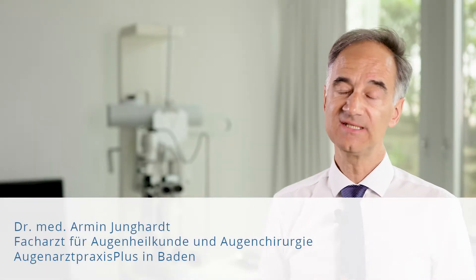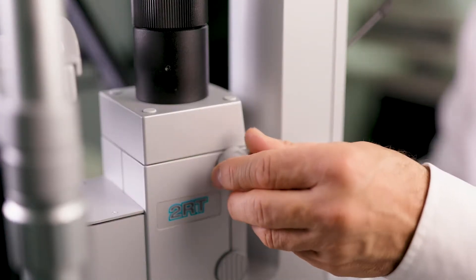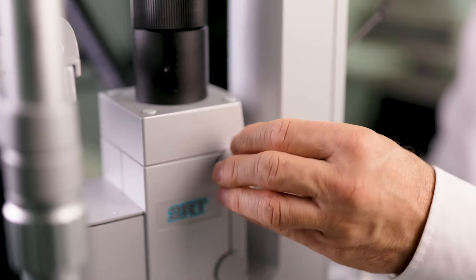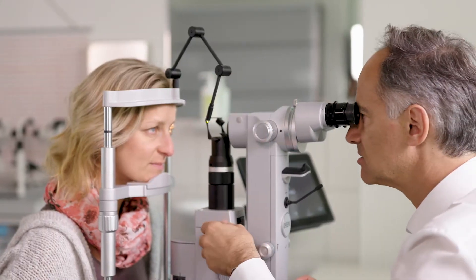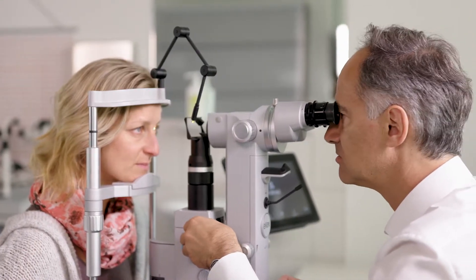The laser development has taken more than 10 years, which resulted in a very good product. We started on July 1, 2016 with the 2RT treatment, and since then we have performed a total of 160 laser treatments in macular patients.